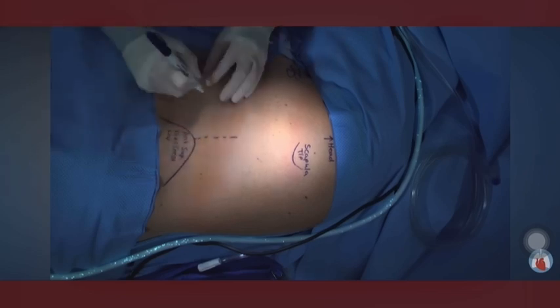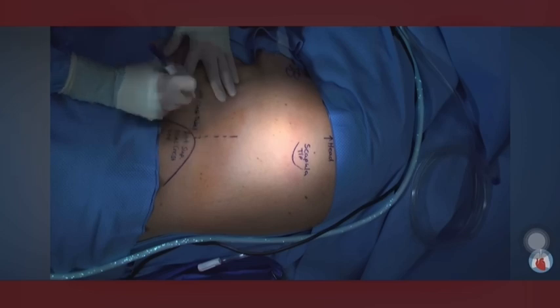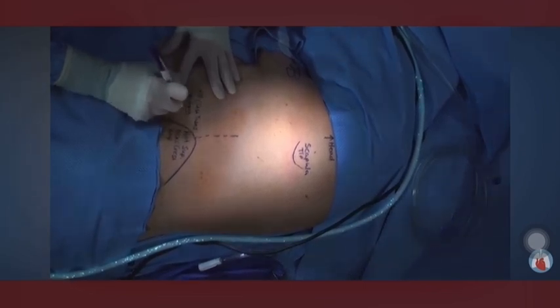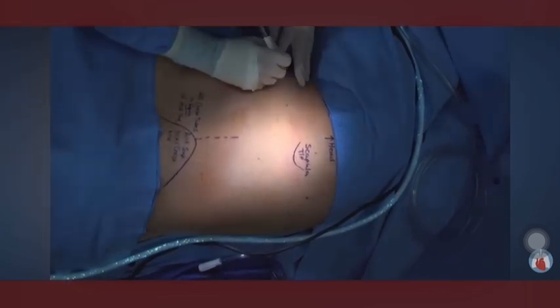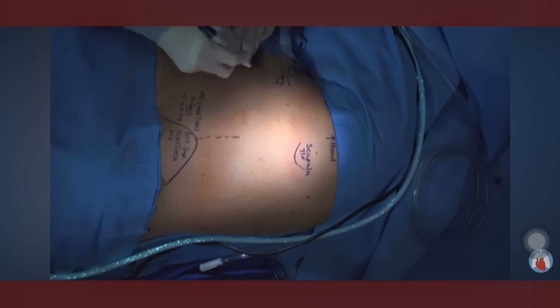Next, feel for the anterior superior iliac spine. Between these 2 points is going to help you to identify your mid-axillary line. It is ideal to place chest tubes in front of this line for patient comfort so that they're not laying on the chest tube. There are, of course, some special circumstances in which an alternate location will be required, in particular if you're aiming for a loculation, and sometimes you are limited by casting or hardware. Next, identify the nipple and the inframammary or pectoral crease. This is the line in which you're going to be placing your chest tube.